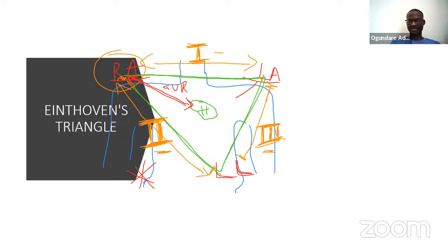And from the left arm to the heart, that will be the AVL. That shows as the AVL. Then from the left leg to the heart is AVF. The F here is like the foot. Okay, so AVF. So I hope this is simple enough.